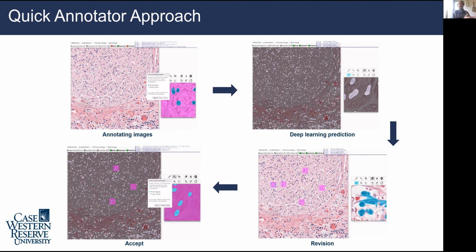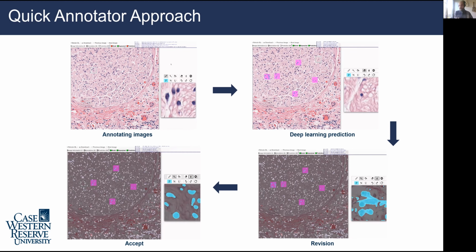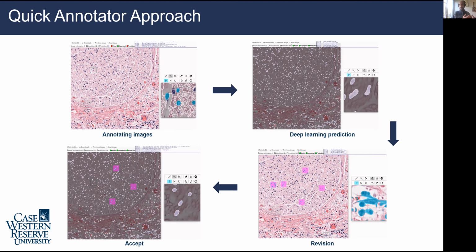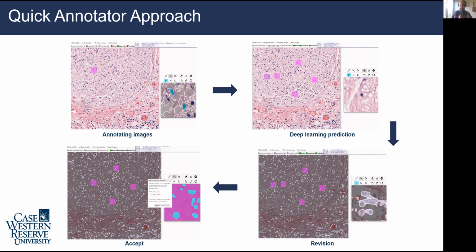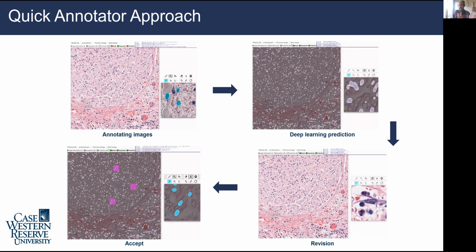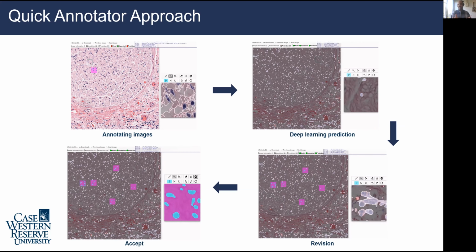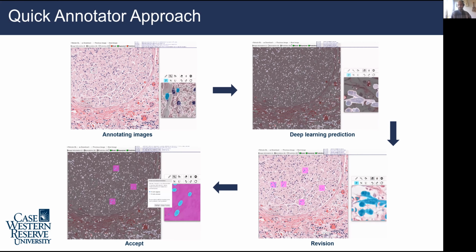So now instead of annotating it, we'll say directly in QuPath in a kind of linear manual way, here you still have to annotate it if it's done poorly, but you stand the chance of that classifier being able to pick up on that signal and then incrementally get better. So over a period of time, the sky's really the limit. You can absolutely obtain regular UNet level performance, but maybe your data set is actually already fully annotated by the time you get to that point. So there's kind of a trade-off there, but regardless, I see no loss of time in doing an annotation in this manner versus trying to do it manually.